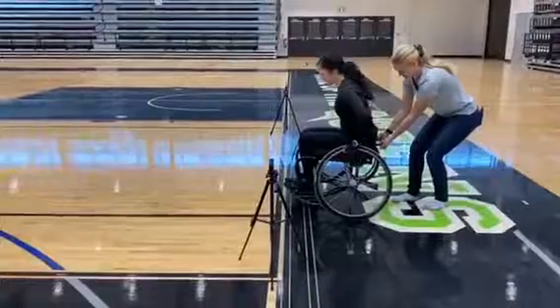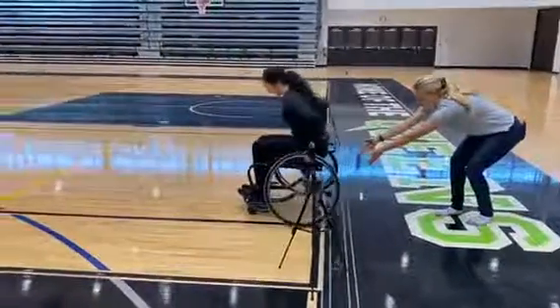The timing gates then will be set directly across from one another according to the tape that's placed on the floor. As you can see, the timing gates have been adjusted so that they're sitting at their lowest setting, and that is so that they are set off by the wheel.